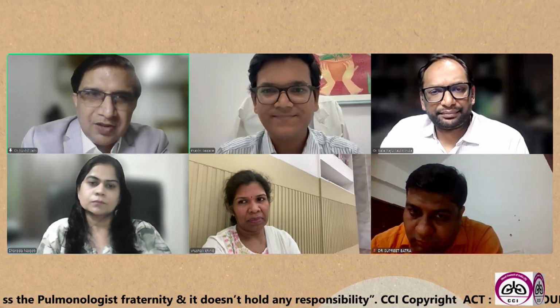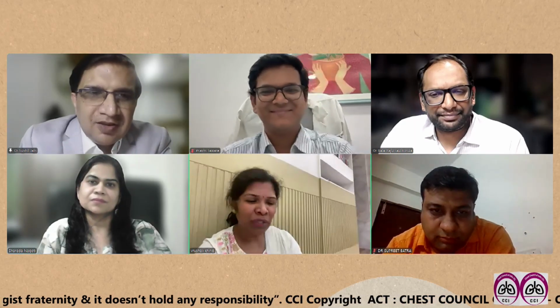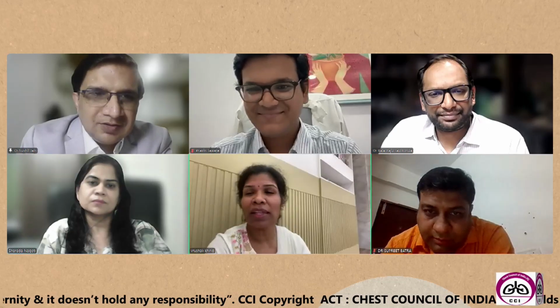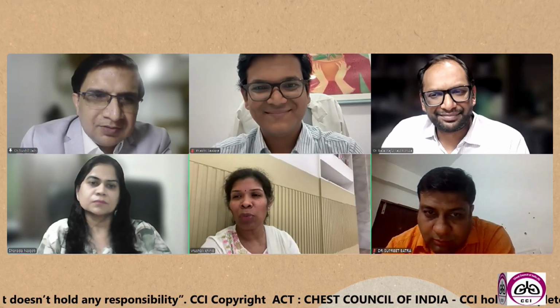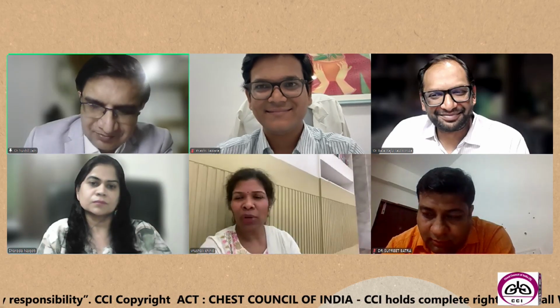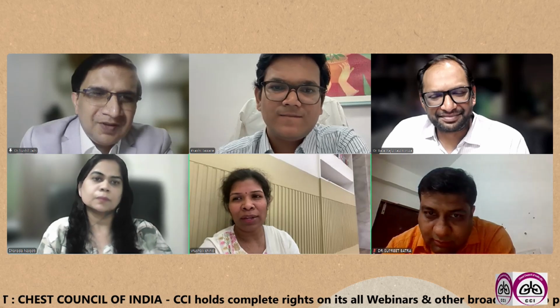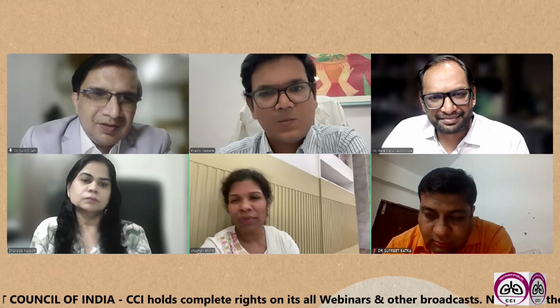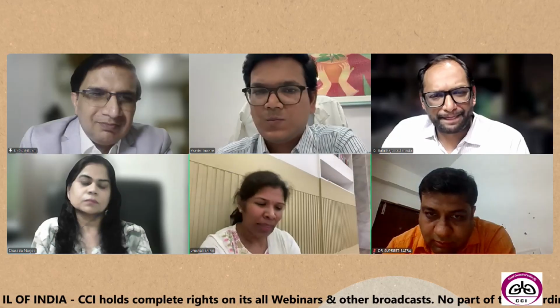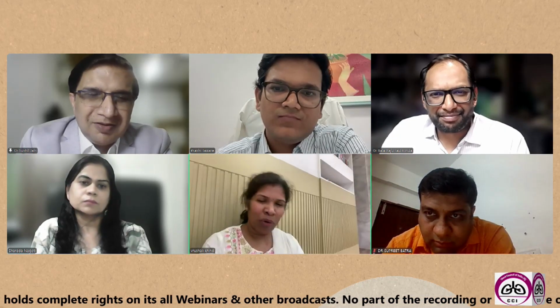Thank you. That's a nice summary. Thank you, Dr. Vrushali. So you said that the needle was inside the node, but still they were having a tough job finding it. So does this have something to do with using or not using a stylet? Just a word from each of you. If you use a stylet while entering and then have a gradual pull out or a capillary pull, will that prevent the bronchial epithelial cells from spoiling your sample?